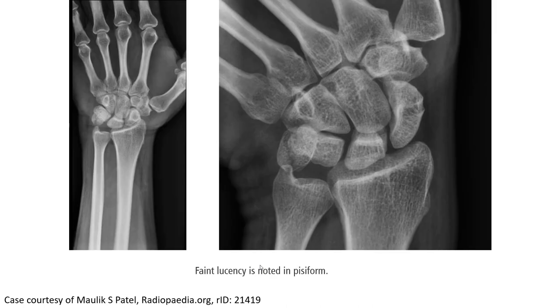Another case. On the left is the AP radiograph. And on the right, we can also see a faint lucency line across the pisiform, like in here. And this image we can see here. This is a pisiform fracture.